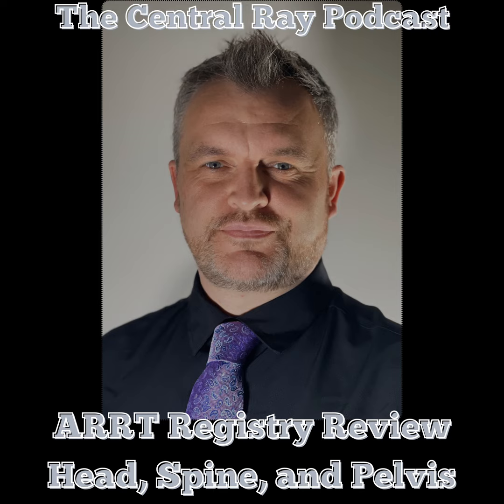So to summarize, we have covered anatomy, positioning, patient adaptation, image evaluation, and common pathologies of the spine. Here are a few questions to test yourself. Which projection best demonstrates the cervical zygapophyseal joints? In lumbar obliques, which side of the joint is visualized? And what fracture is associated with a hyperflexion injury?